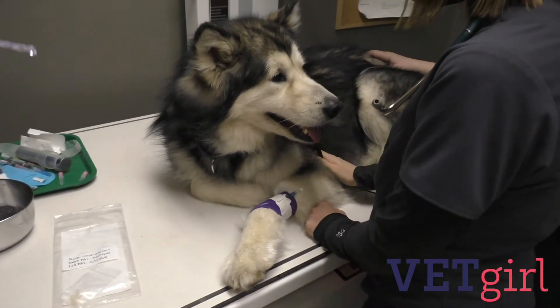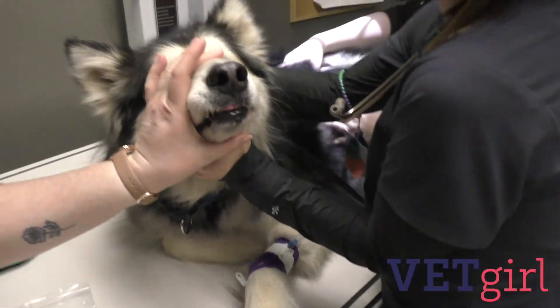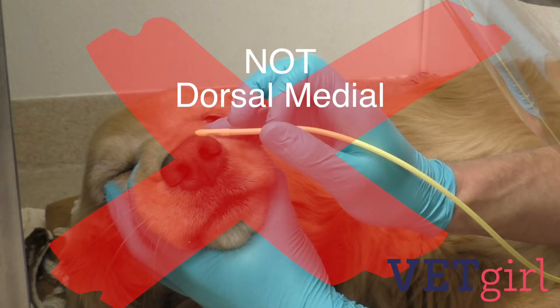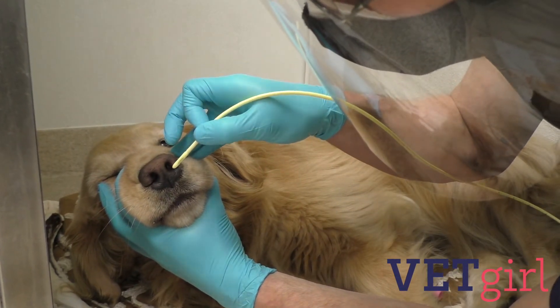Prepare the patient in sternal recumbency and, using short, rapid, intentional movements, insert the tube into the nasal passage toward the ventral meatus while aiming medially towards the pre-marked location.